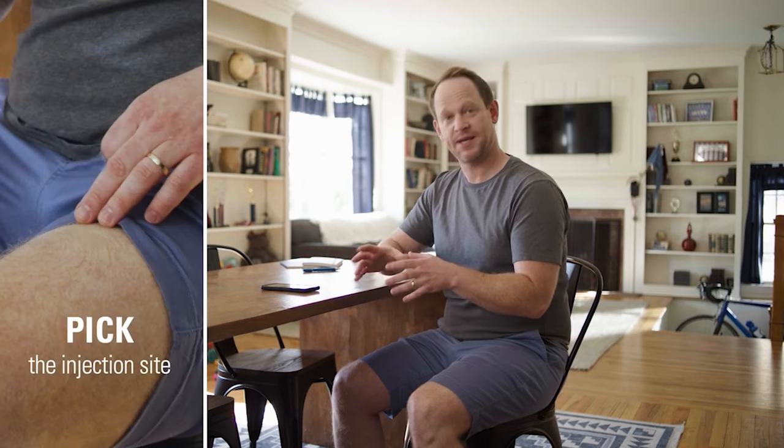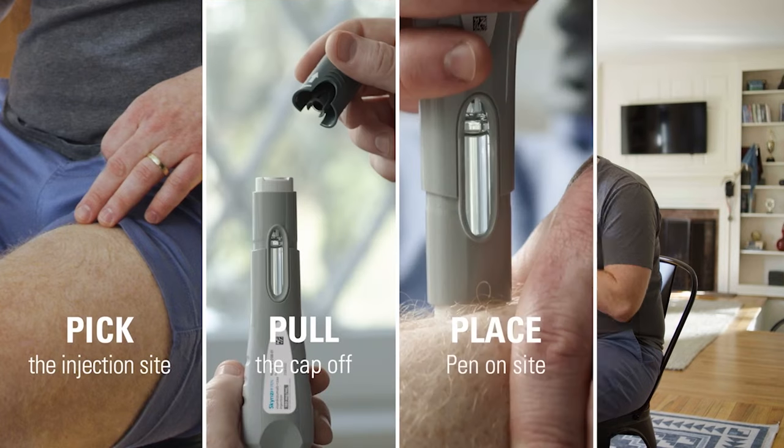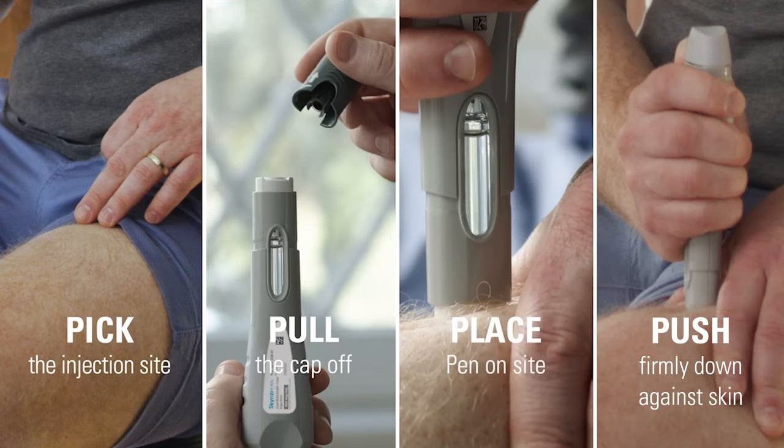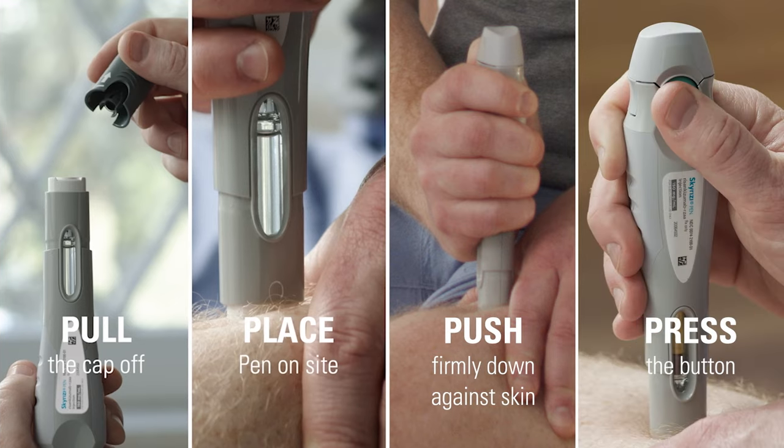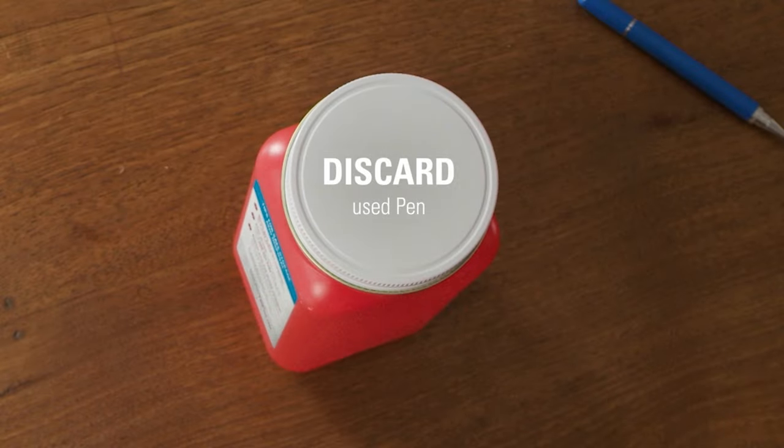To recap: I prepare myself and my space, pick an injection site, pull the cap off the pen, place the pen on the injection site, push the pen firmly down against my skin, press the button to inject, and keep steady pressure on the injection site for the full 15 seconds. Then safely discard the used pen. That's the whole injection process.